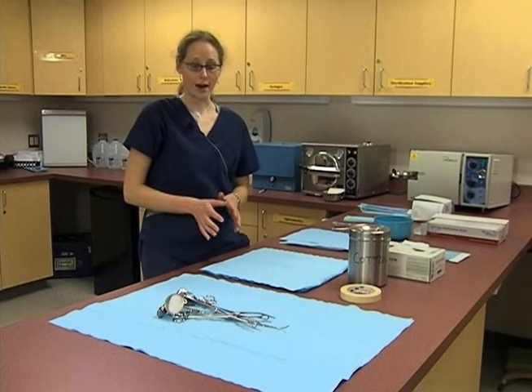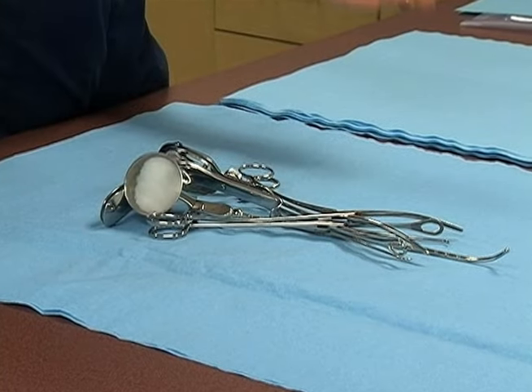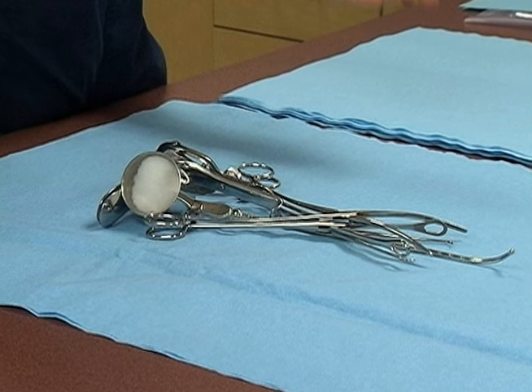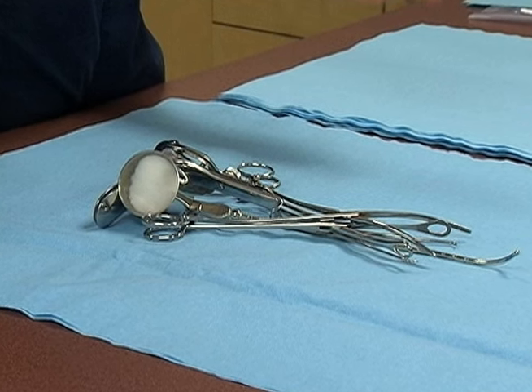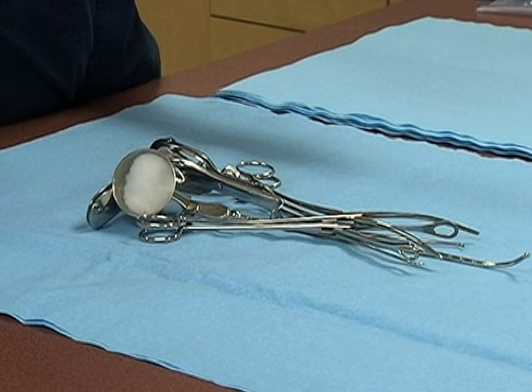Now, before we get started with doing the autoclave, we need to make sure that we have all the necessary supplies. Of course, we're going to need the surgical tools. And before we can wrap the surgical tools, they need to have been sanitized with a disinfectant and rinsed and then dried off. They must be completely dry before going into the autoclave because we can't get any of the paper wet and we cannot be introducing any excess moisture to the autoclave.